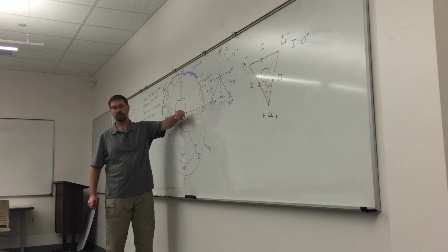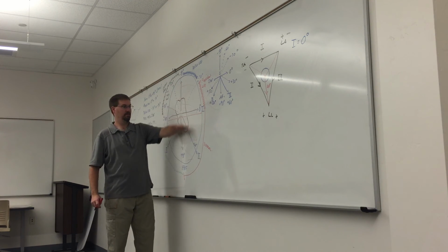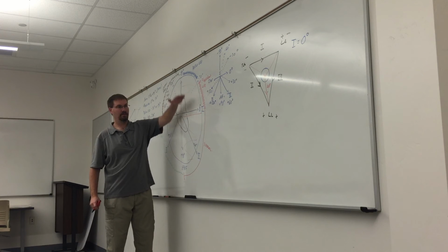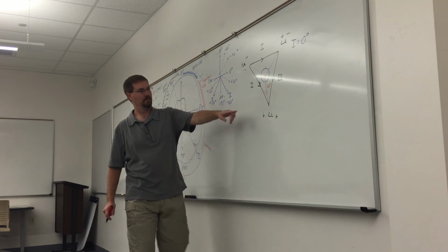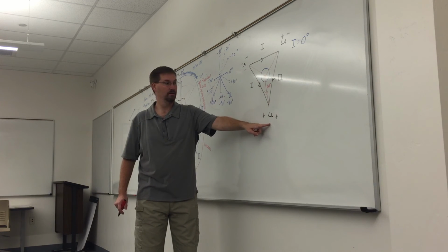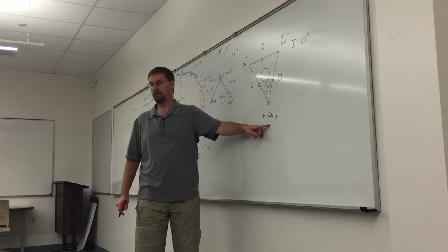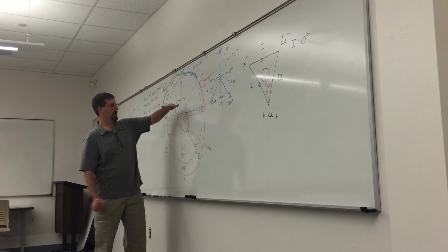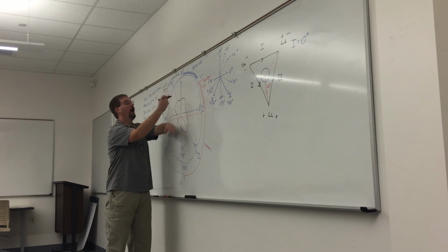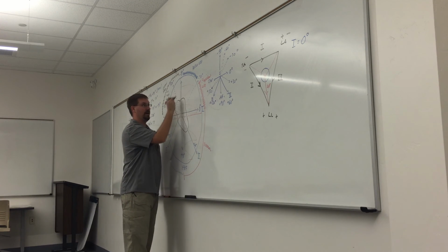AVF moves in this direction, right? And the QRS is negative. Look at AVF on your paper, is it positive or negative? It's negative, so am I moving this way or this way? Up. Are you guys okay with why I'm going to draw up in this direction here?